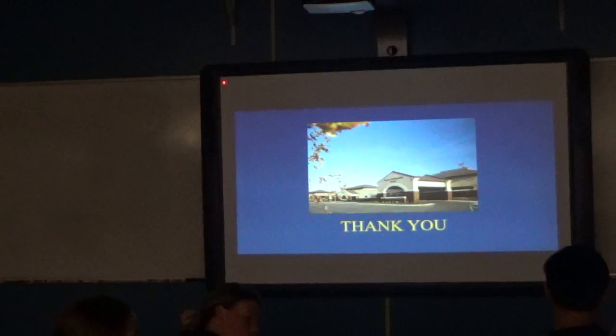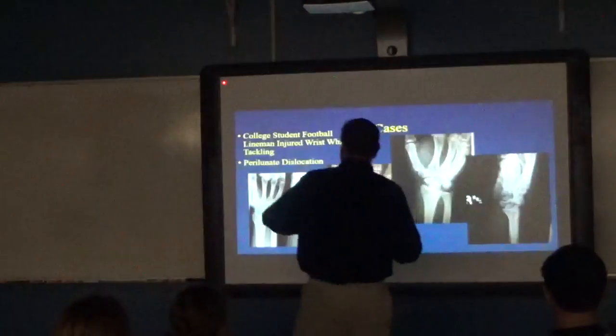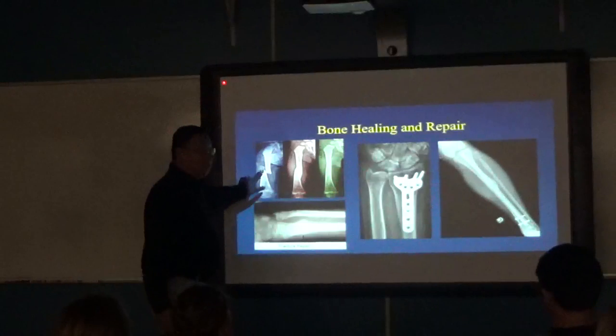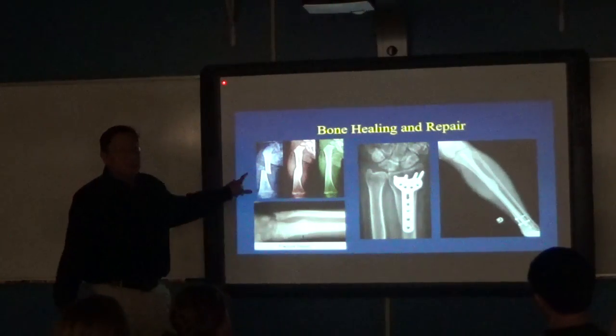There's that one X-ray. I think you said it was a little kid and the femur bone. How come you didn't realign it? Before that nail. This one, yeah. How come you didn't realign it? Don't need to, because kids will heal.